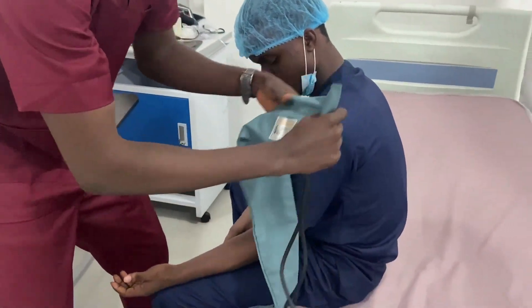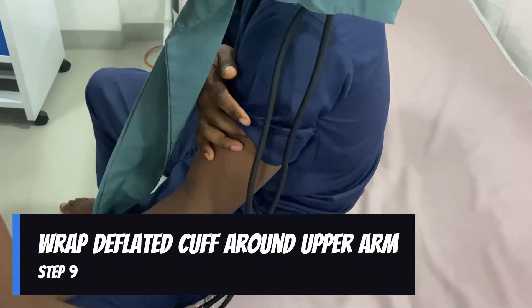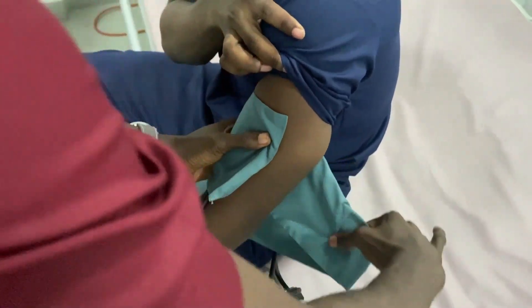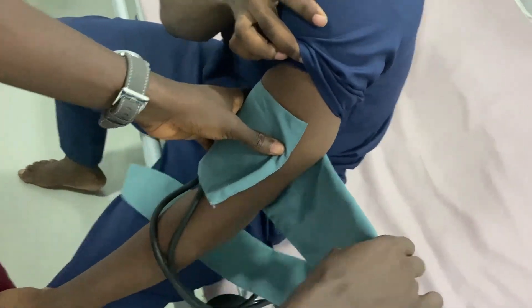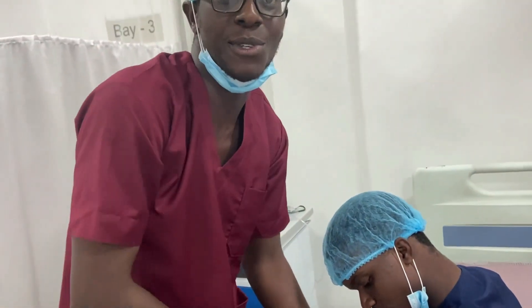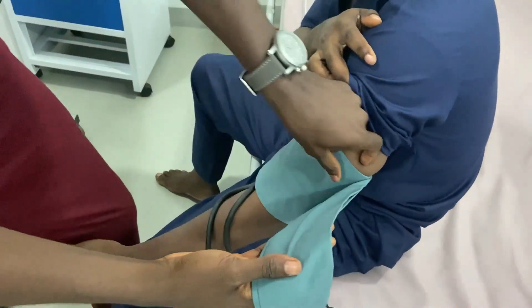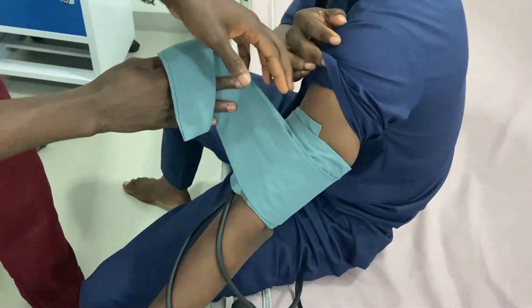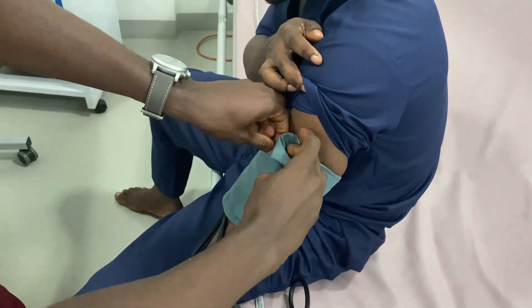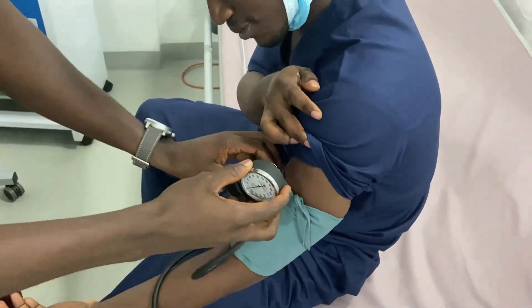As you tie the cuff, make sure the tubes are overlying the brachial pulse, which is at the cubital fossa. The cubital fossa is important for checking blood pressure. Once you've done this, your next step is to position your gauge so you can see it clearly.